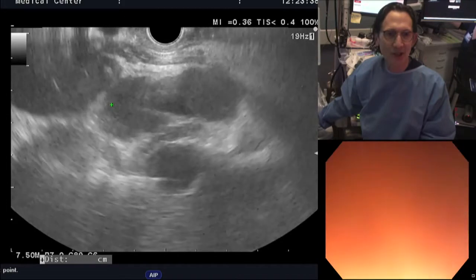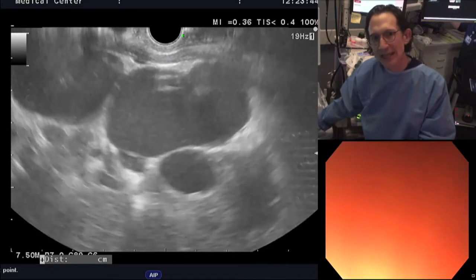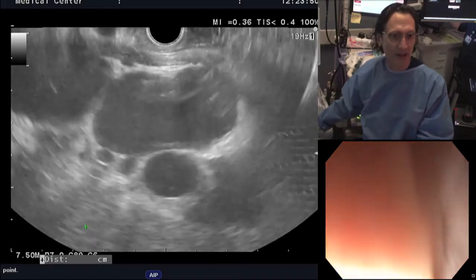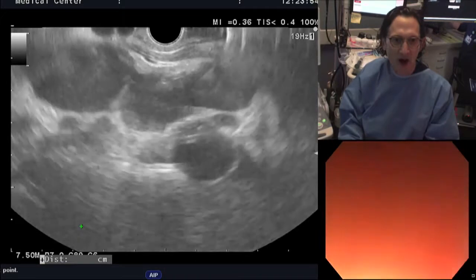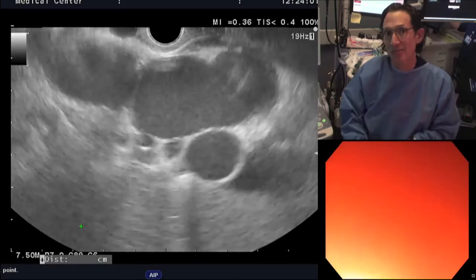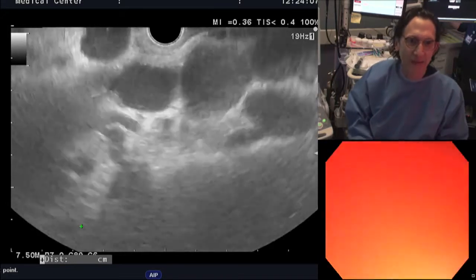Why? Because there are huge gastrorenal shunts here, gigantic, and we don't want to treat those. So to go transesophageal means we would have to go through the gastrorenal shunts to get to where the fundus is, which is down here. The fundus has been displaced because of these huge gastrorenal shunts. So that's actually not an option. Now, I prefer to go transesophageal if I can, but I can't. This is not an option for this patient.